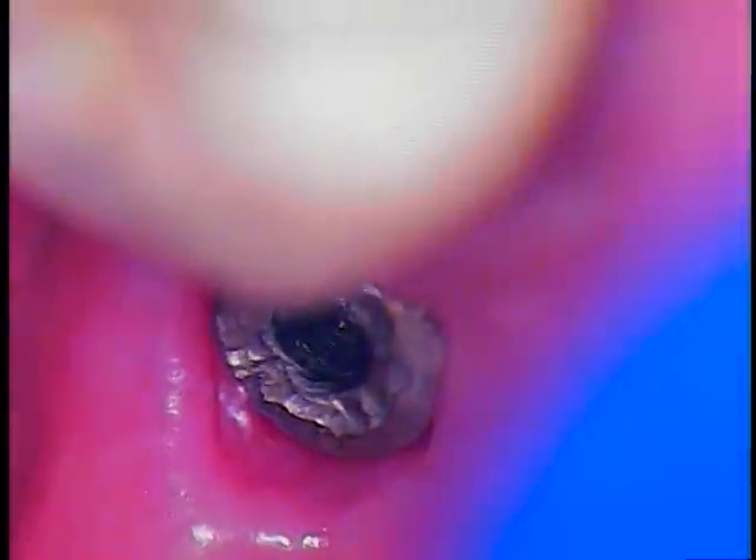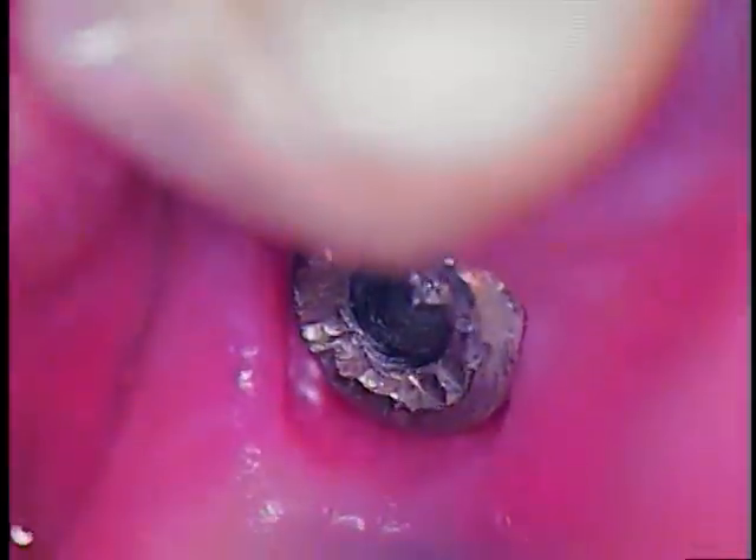So you can see visually — take a look inside. So we have at least we can see about three quarters of what's going on internally.